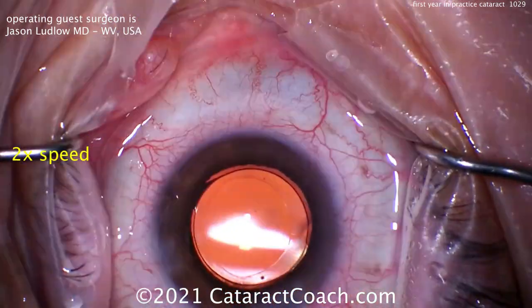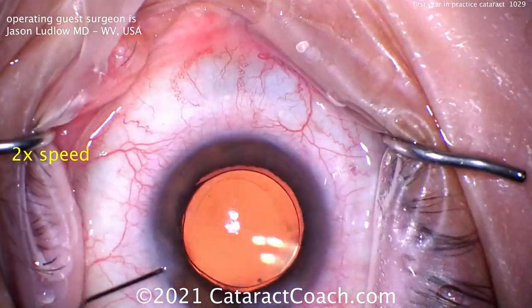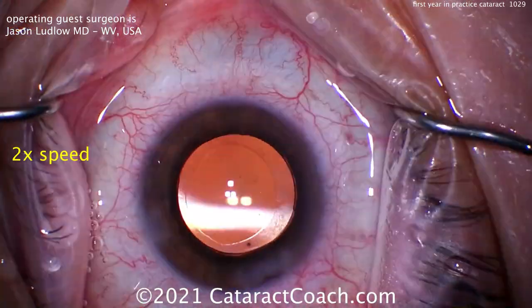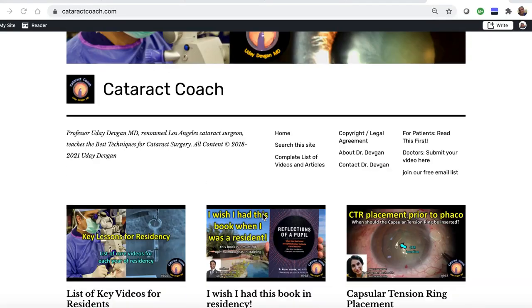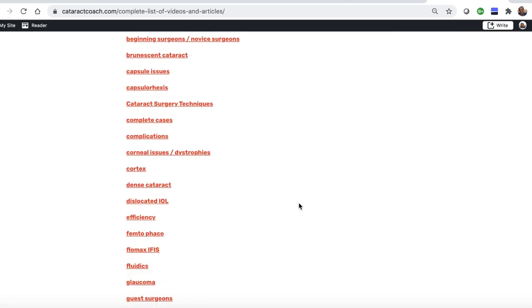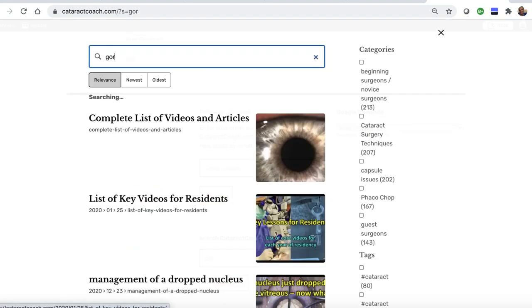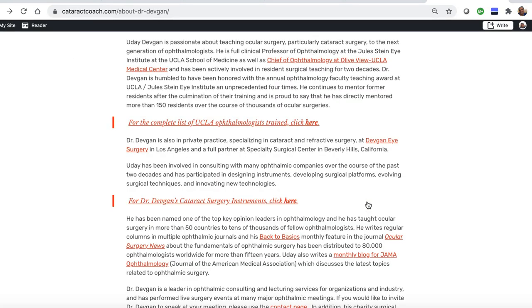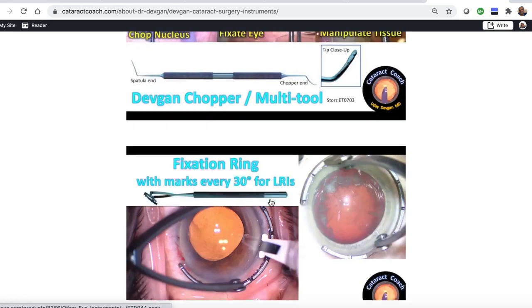Sealing up the incision. That looks fantastic — what a beautiful case. Checking the incisions: looks good to go, good pressure. Fantastic job. Thank you, Dr. Ludlow. I really appreciate it — you're doing a fantastic job, keep up the good work. I know you love the YouTube videos, but check out the website cataractcoach.com. Lottie will help you navigate. We have a complete list of articles and videos, you can explore any category, and there's a very effective search engine. You can also look up about me, including a link to my surgical instruments — so you don't even have to ask what the name of those forceps is.